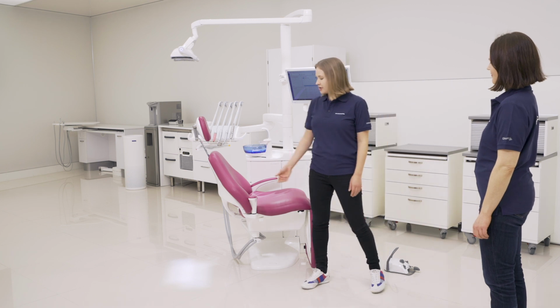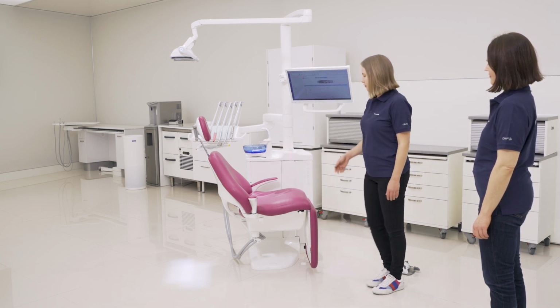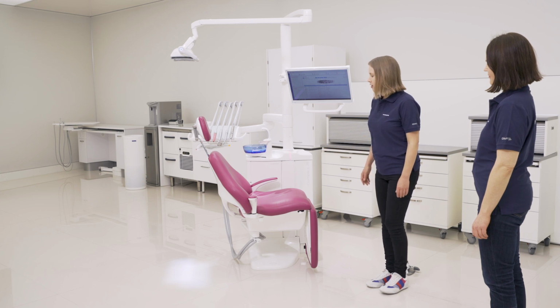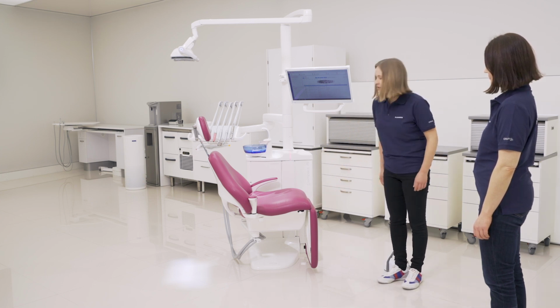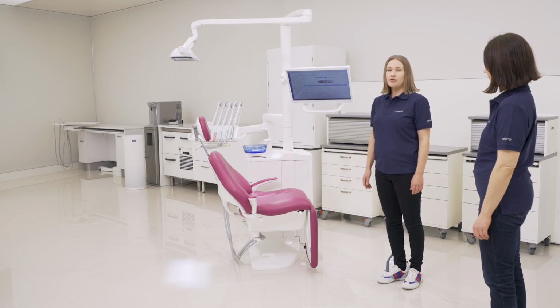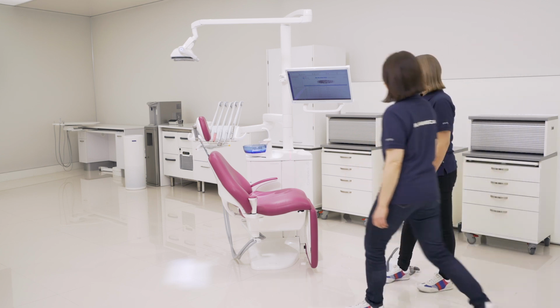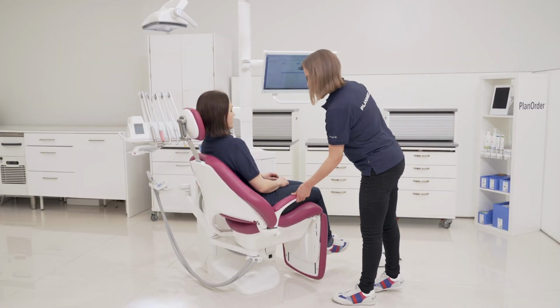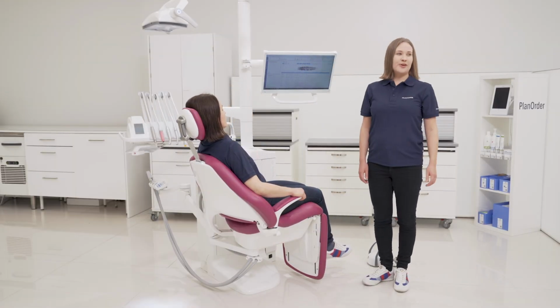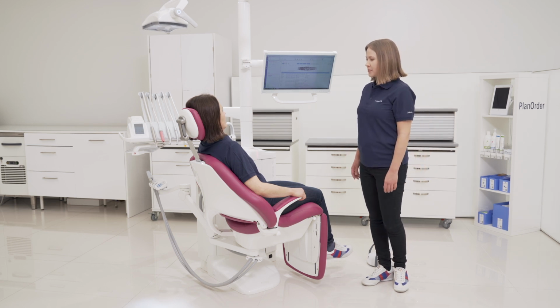And of course, the reason why we can rotate the armrest is that it would be easier for patients to enter the chair. Another thing that makes it easier for patients to enter is this automatic leg rest. So also older patients or my senior colleague can easily enter the chair.